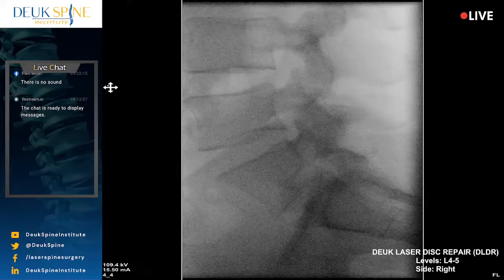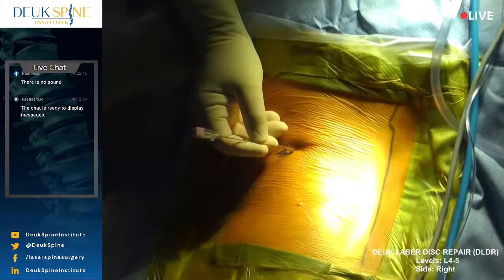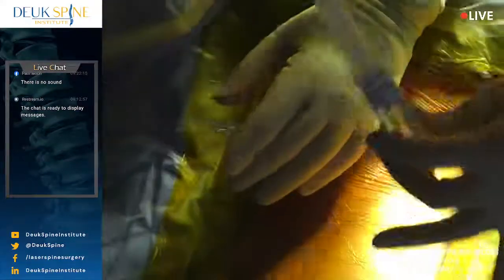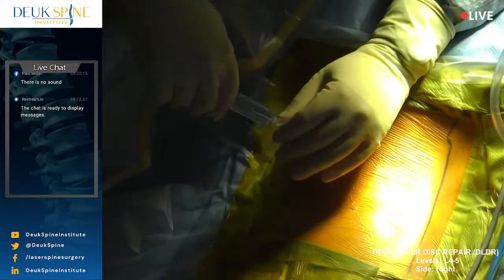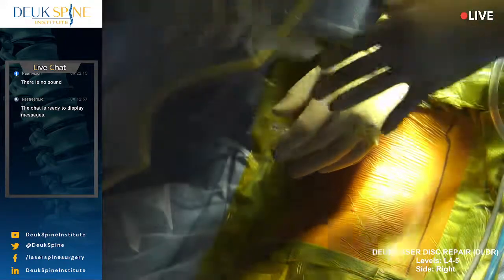All right, sounds like the blood pressure is heading in the right direction. Let's just see where we are. I should have given him a little bit of numbing medicine while I was waiting. You're doing fine, I promise you, okay? Yeah, that's just a little more numbing medicine.